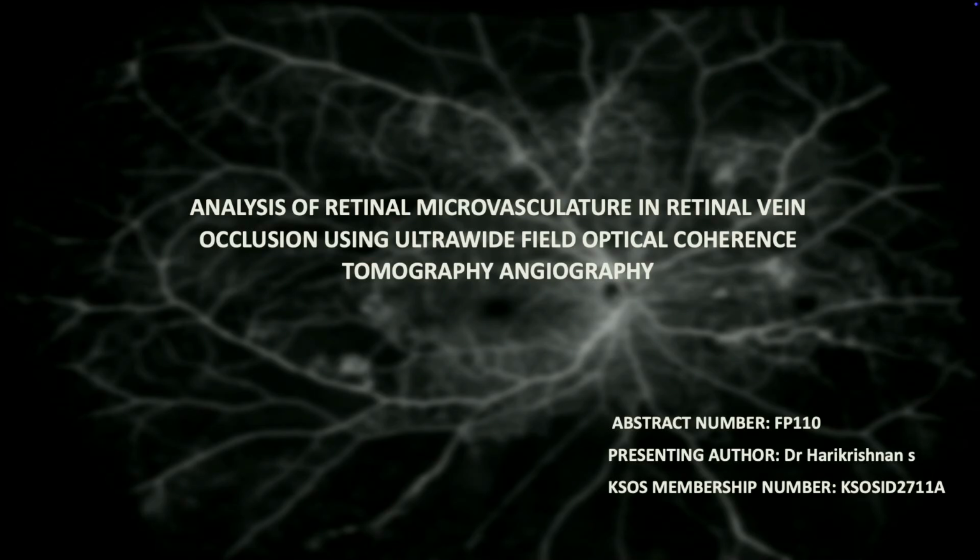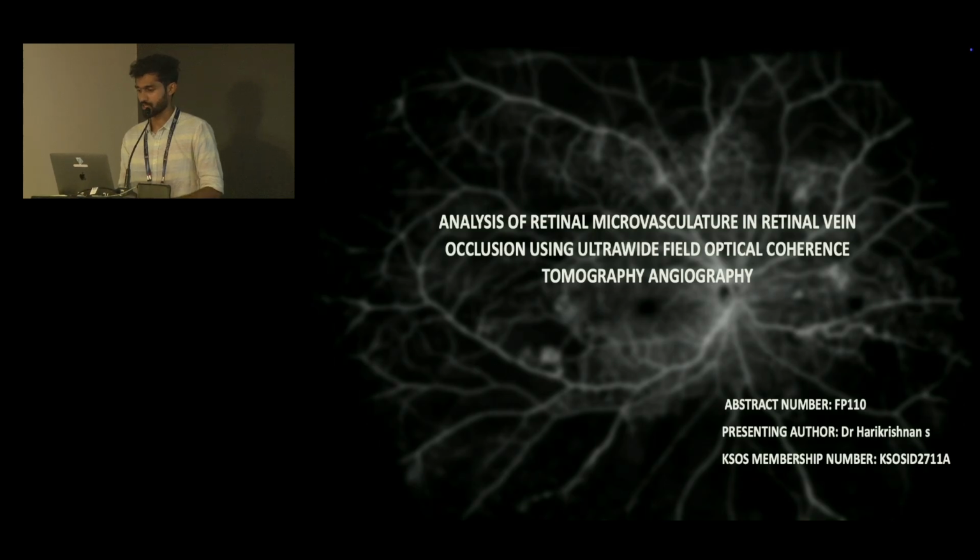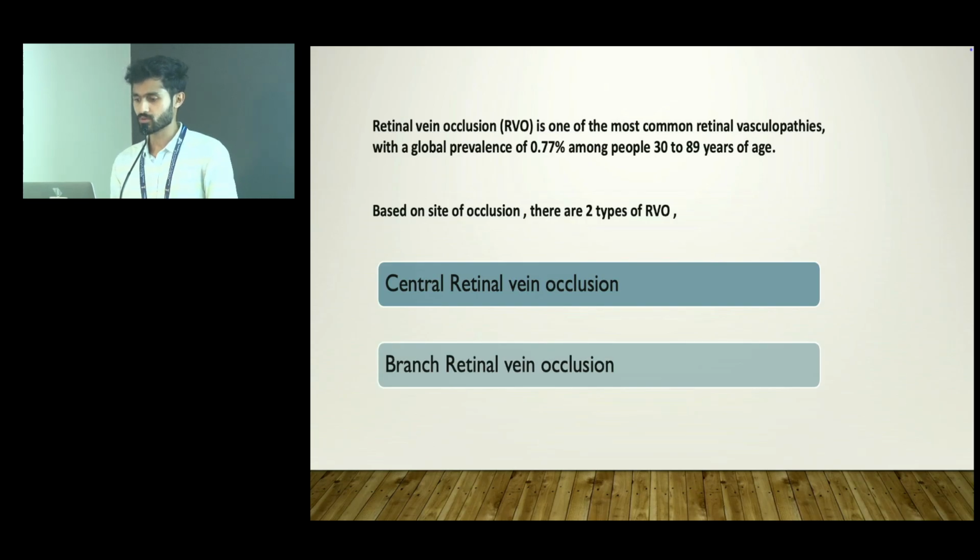My topic is analysis of retinal microvasculature in retinal vein occlusion using ultra-wide field optical coherence tomography angiography. Retinal vein occlusion is one of the most common retinal vasculopathies with a global prevalence of 0.77% among people from 30 to 89 years of age.